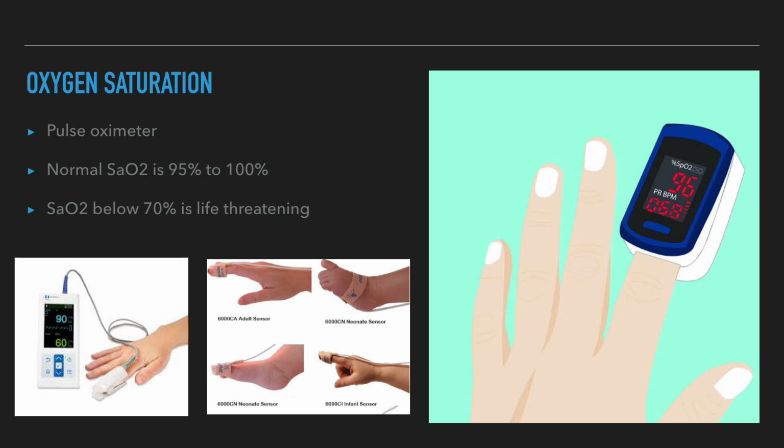A pulse oximeter is a non-invasive device that measures a client's arterial blood oxygenation by means of a sensor attached to the client's finger, as shown in the image, or toe, nose, earlobe or forehead, or around the hand or foot of a neonate. The pulse oximeter can detect hypoxemia before clinical signs and symptoms such as dusky skin color and dusky nail beds develop.